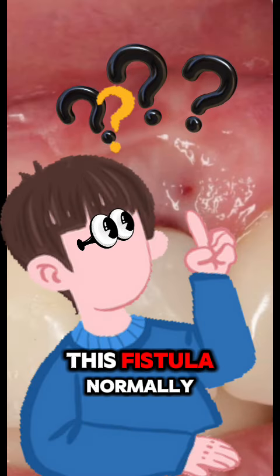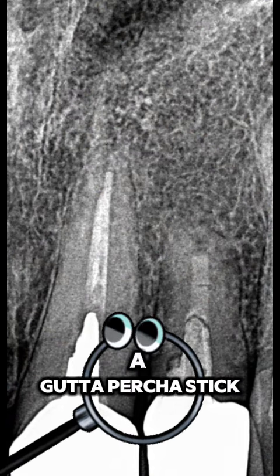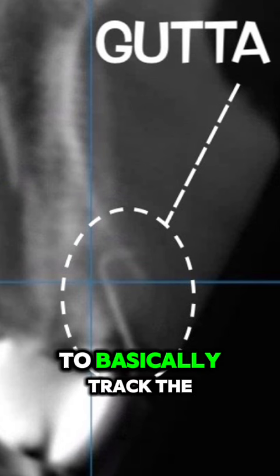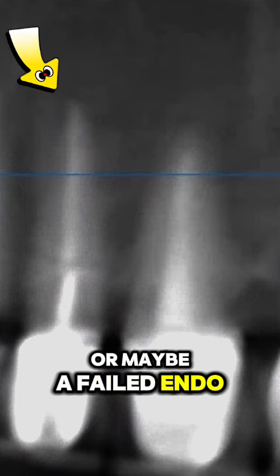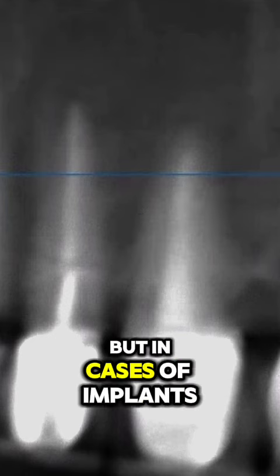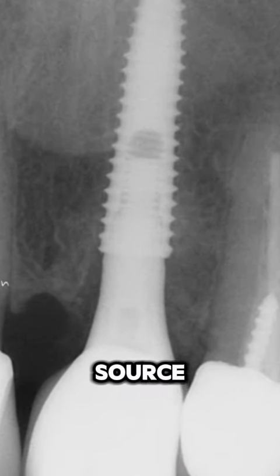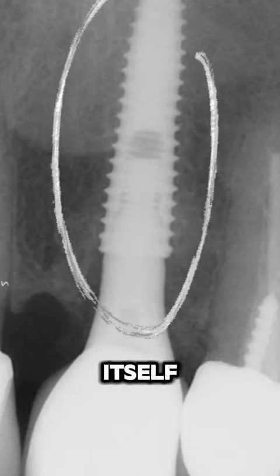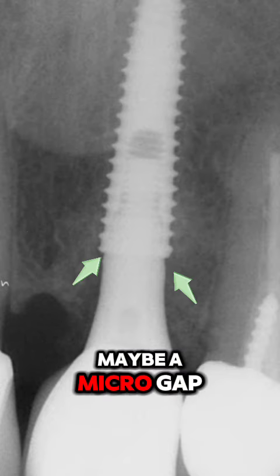This fistula, normally if we look at a normal dentate tooth, we would be putting a gutta percha stick in there to basically track the source of the infection. Very often, the infection may be a fracture in the root, or maybe a failed endo, or maybe a leaky root canal treatment. But in cases of implants, we want to figure out if the infection source comes from the implant itself, the surrounding area, or maybe a microgap.